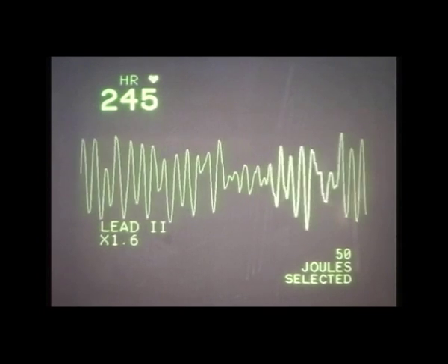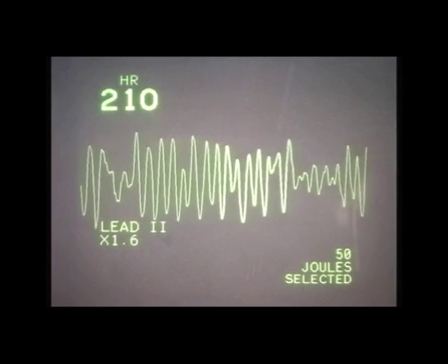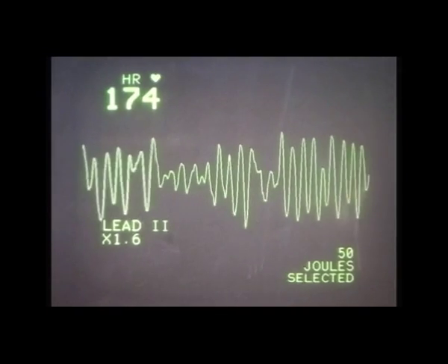So, if ventricular fibrillation is not treated, what would happen to the patient? Well, eventually the rhythm would become a fine ventricular fibrillation, and then into asystole, where there's no electrical activity in the heart at all.